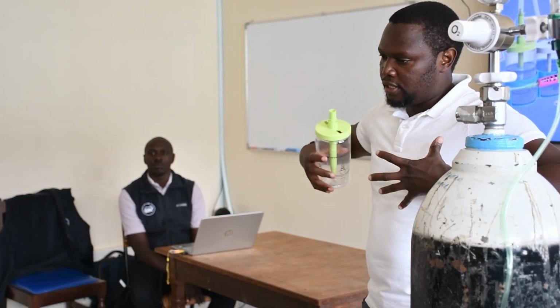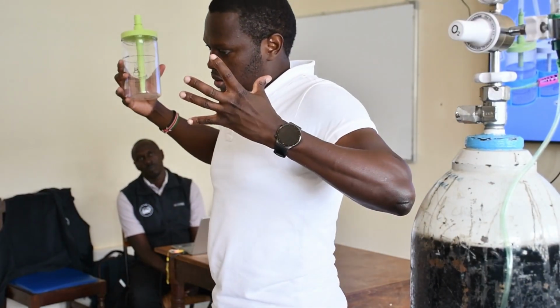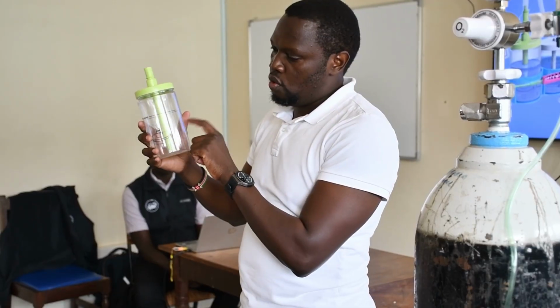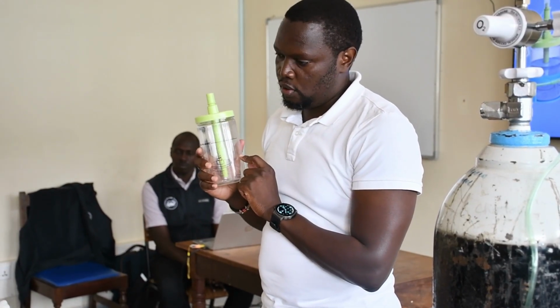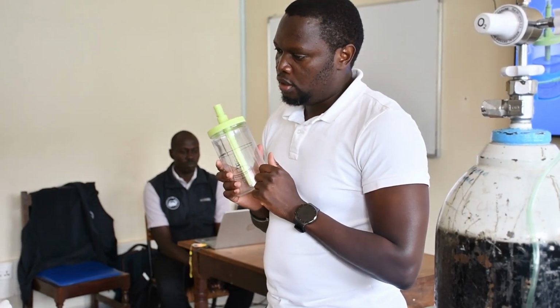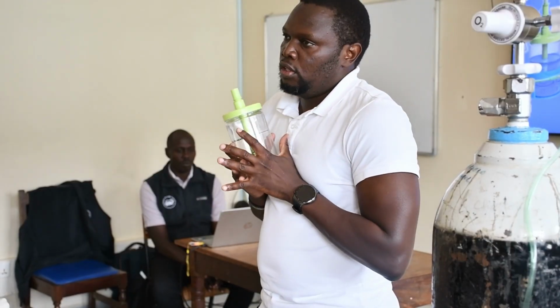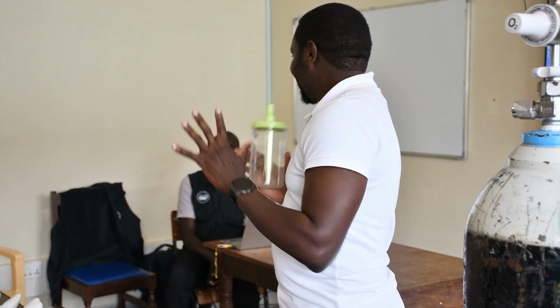So to generate that pressure, depending on how deep this is, determines how much they need to generate to go against this. Push the air. Okay, and that's how the pressure is generated to have the alveoli open.